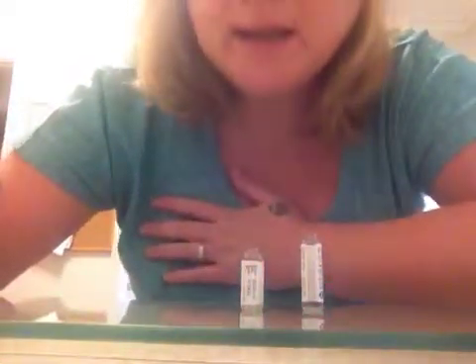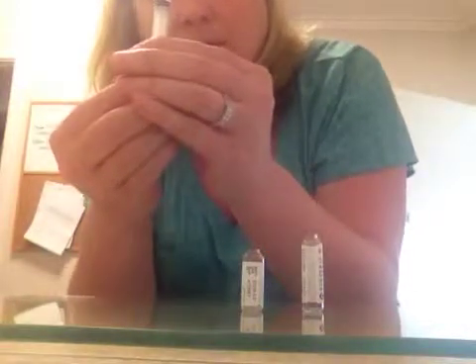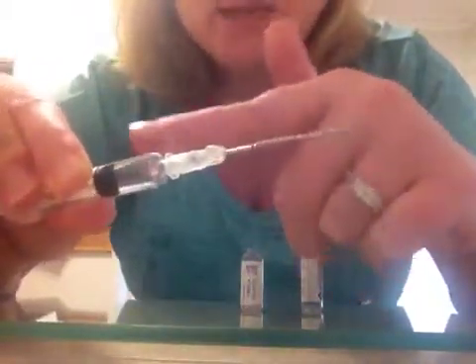It will get bubbles in it — don't panic. If you can't get all the bubbles out, that's fine. Let it sit and the bubbles will go, or just flick it. I wouldn't stress too much — there's plenty of drug in there. Push it up. It's not going to matter if there is a little bit of air in this needle, because it is only going under the skin — it's not going into a vein. So don't stress about a little bit of air; it's just going to go under your skin.